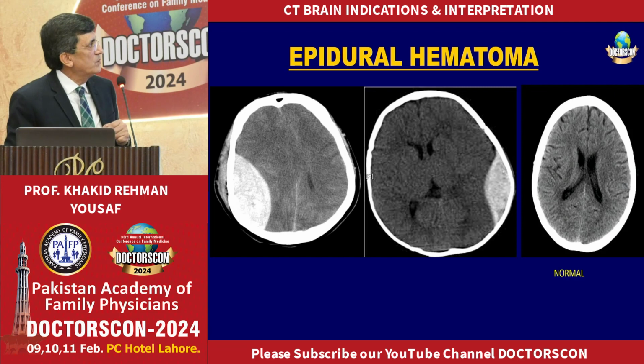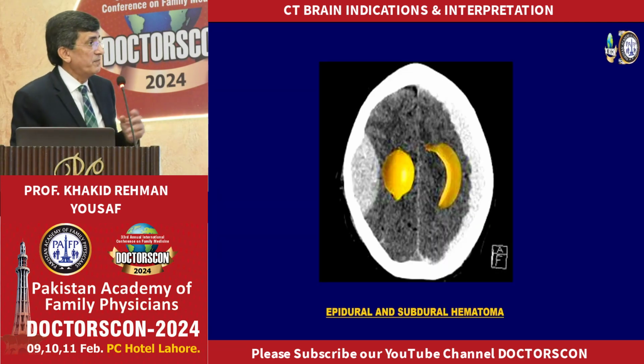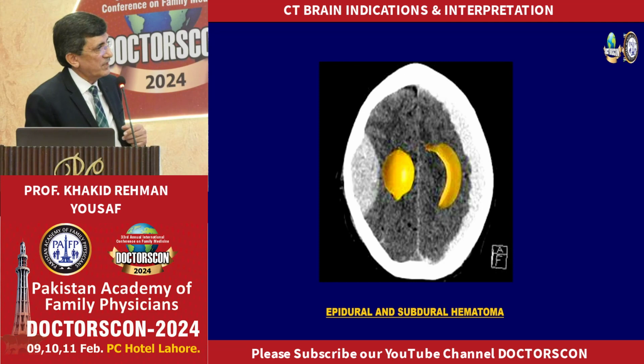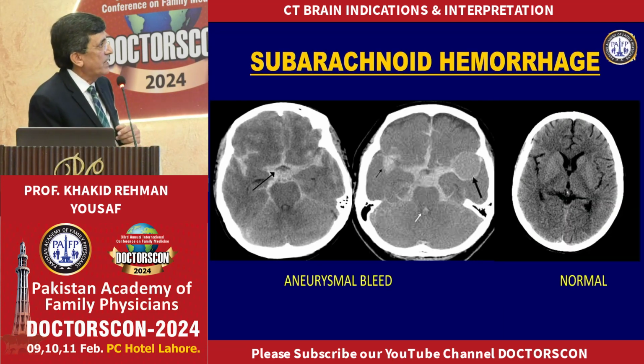Biconvex, I just told you, this is epidural hematoma, and you may see in some patients both types of injuries, like extradural and subdural hematomas. This is very important. You see hyperdensities within the cisterns of the brain. These are diffuse hyperdensities, and the cause is here. This is an aneurysm. This has ruptured, and there is leakage of blood in the basal cisterns of the brain.